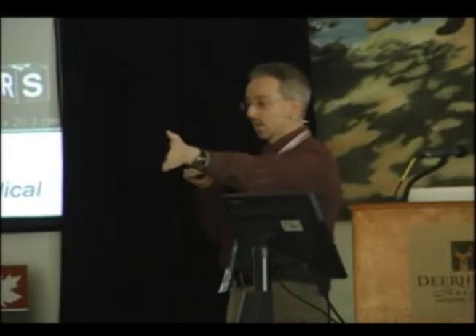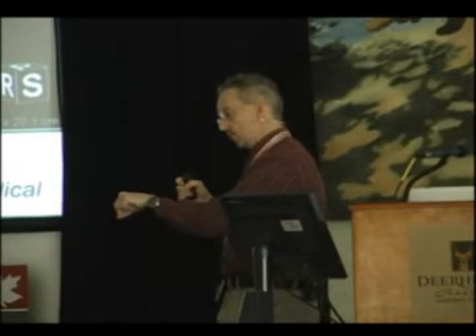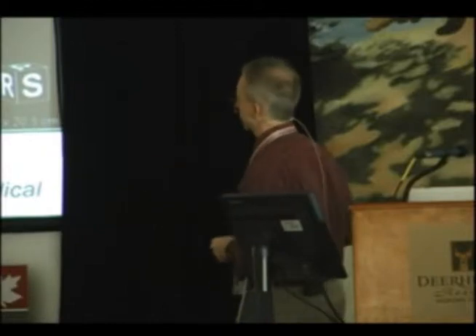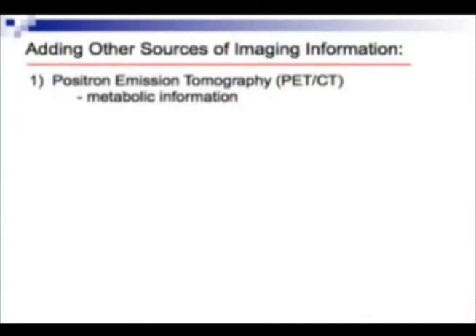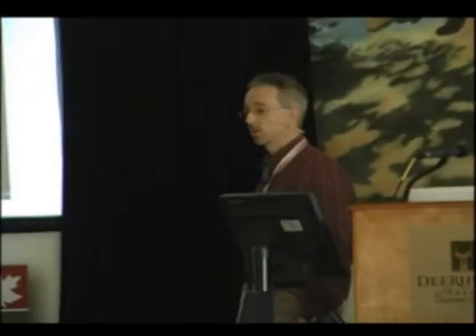This is all done, as I said, you do the imaging, they come out, you put a guide device in, you put them back in, you bring them back out, you put the biopsy device in, so it's a lot of this and that. So not real time. And it's also using an expensive technology, MRI. So as an alternative, add other sources of imaging information to then go outside of that expensive environment.